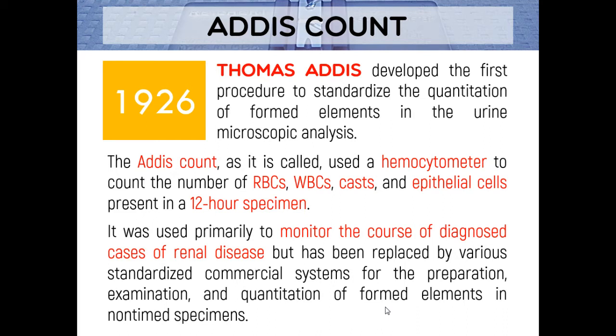But then however, again, this procedure is quite obsolete. It's now replaced by more sophisticated automated methods right now. And these automated methods, they do not require na timed ang specimens, pwede lang non-timed. And in a way, mas accurate pag yun siya. Mas reliable in a way ang result. Because again, kanina mga procedures, they are manual. So, pwede na yung mga variations sa technique sa medtech naga-perform, sa pagbasa pag yun sa medtech. So, in a way, mas okay itong automated, mas na-accurate na siya. Okay? Alright. So, that's why in a way, one of the reasons po nga na obsolete na sila ng mga methods. Alright? So, again, that's for Addis count.